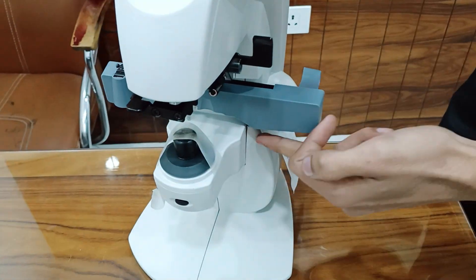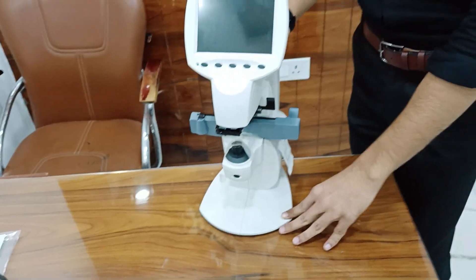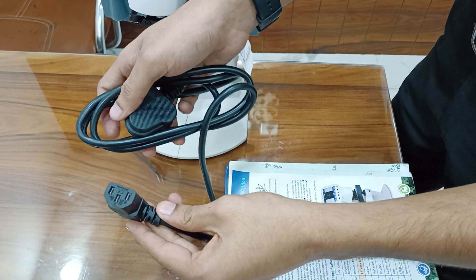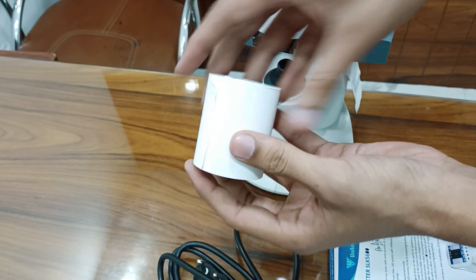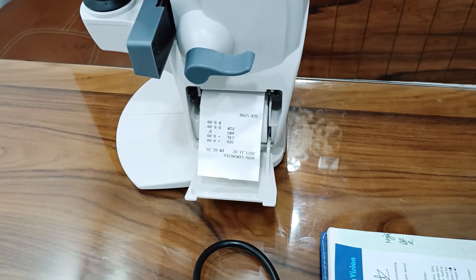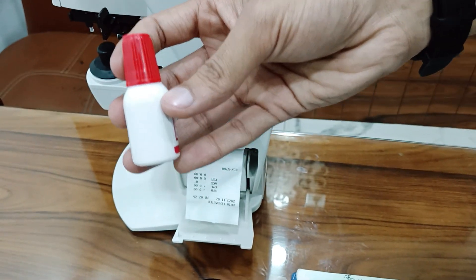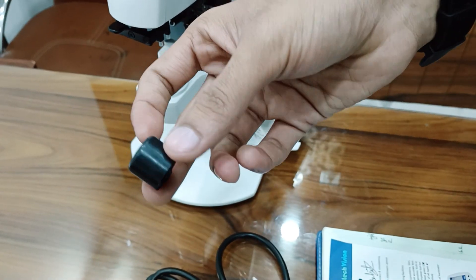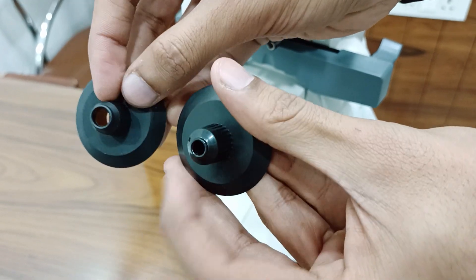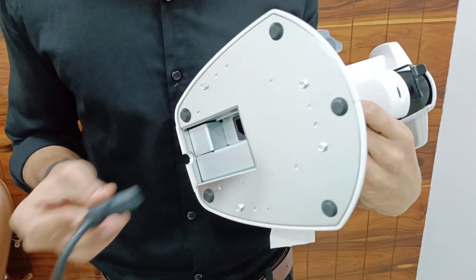Dimensions are 194mm, 210mm, and 408mm. Weight is 3.6 kg. Accessories include a power cord, one extra printer roll, one paper roll inbuilt and one paper roll extra, one bottle of ink, a lens cover, and two lens brackets — one for glasses and one for contact lenses.